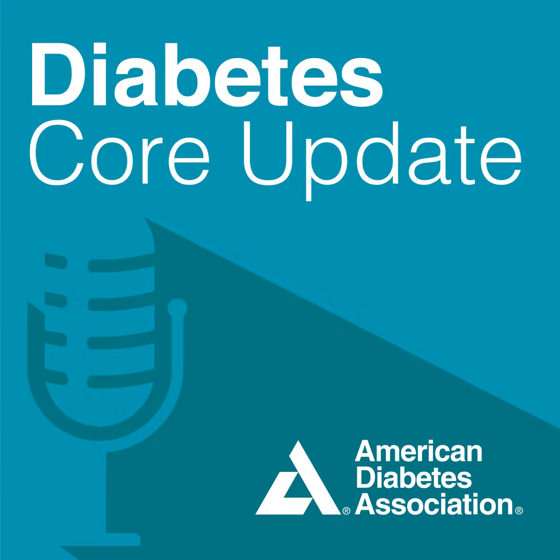The third thing I like to look at is the mean average glucose and the glucose management indicator, or the GMI. This is in the lower portion of the statistics section, and it's an indicator of the mean average glucose over the time that the sensor is worn, and that represents the data that's captured. This roughly correlates to what we would say is an estimated A1C if you were to live for 3 months like you did during the 10 to 14 days that you were wearing the sensor.